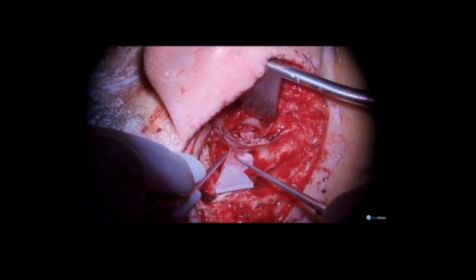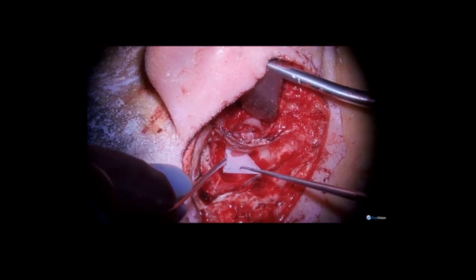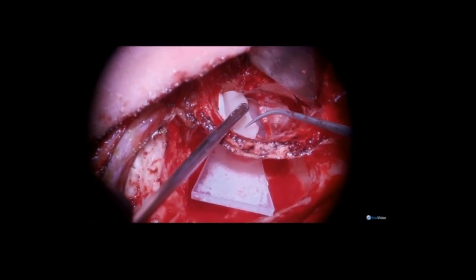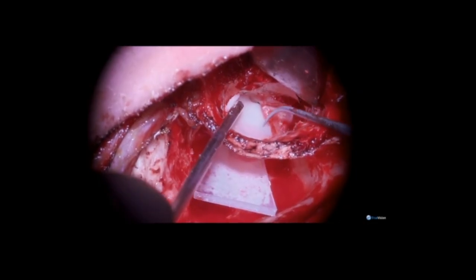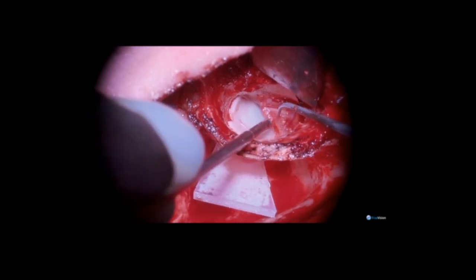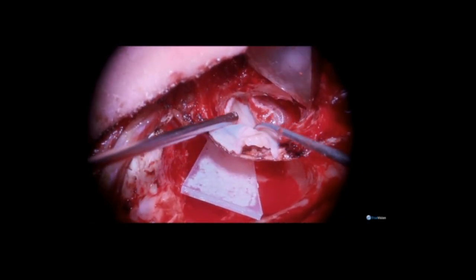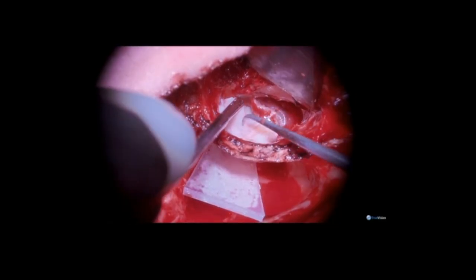Note the shape of the thick silicone that will be implanted into the middle ear and then removed during the second look reconstruction. It is fashioned so that it stabilizes the cartilage graft and has a point to introduce into the eustachian tube region. First, I have placed the cartilage graft, and now I am using the perichondrium to reinforce the reconstruction.